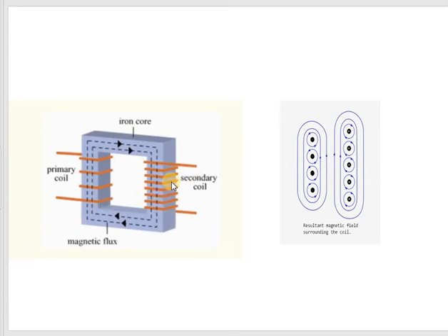So through an AC supply, let's say we're working on a 3-phase AC supply, when there is a changing voltage from the power supply applied to the primary coil, the EMF generated by the primary, through Faraday's laws, generates magnetic fields, and that will induce voltage in the secondary coil, which also fulfils Faraday's law.